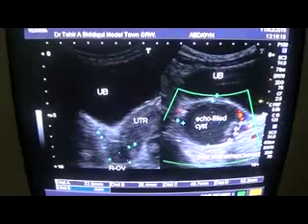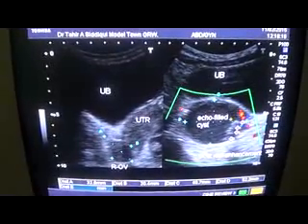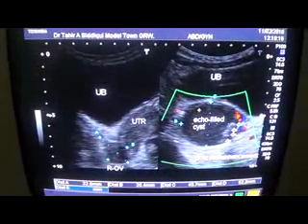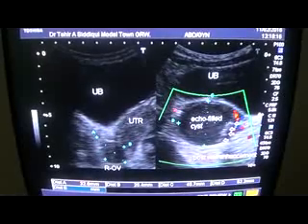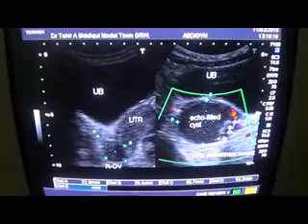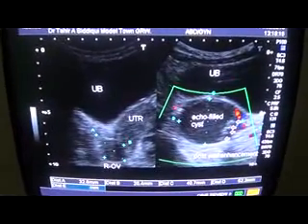Now you see that on the right side of the screen, you see the urinary bladder, and there is a cystic area, this one, measuring approximately 5.2 into 4.0 centimeter. It has a thick wall, this is the wall, and it's filled with echoes, and on the medial side of the cyst, marginal echogenic particles are seen.